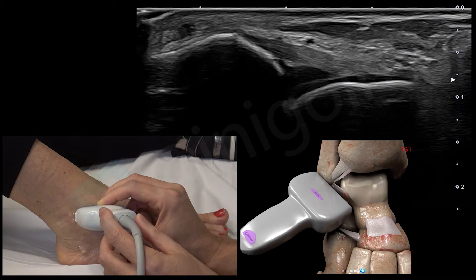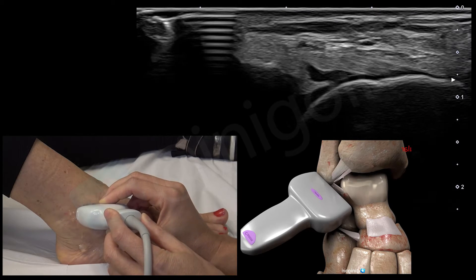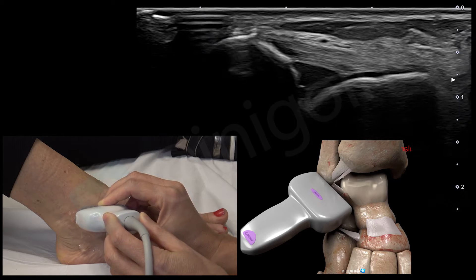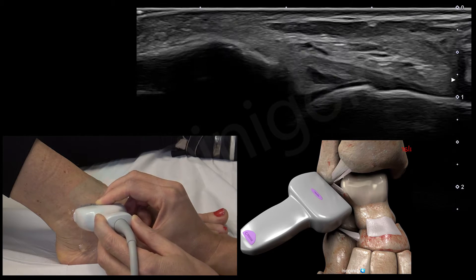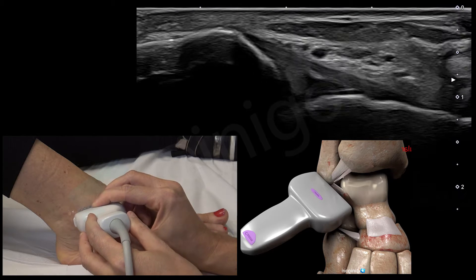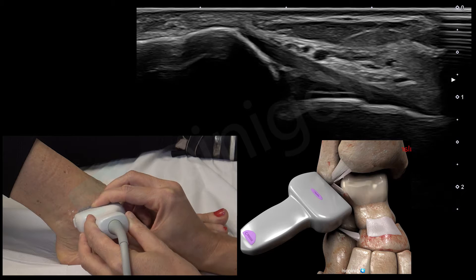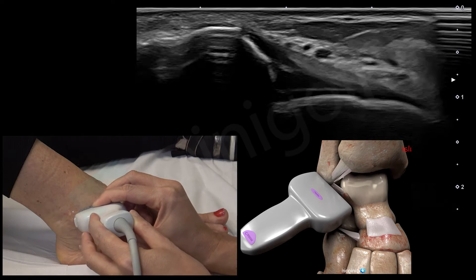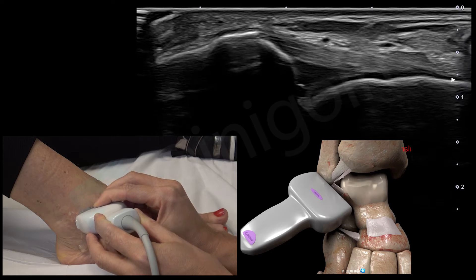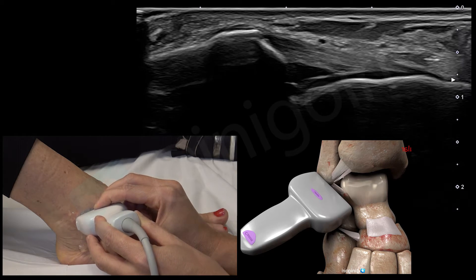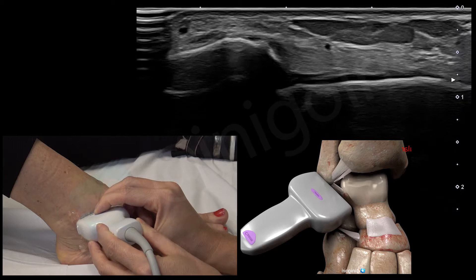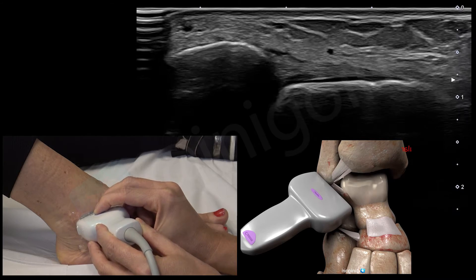Notice that if we push this side of the probe, we will reach a better image, because if we are pushing the rear of the probe we have anisotropy, and sometimes we can think that this is a mildly injured ligament — but this is not. This is a normal ligament. Always take into account that the orientation of the probe is very important to check this ligament. There are two fascicles: the superior one is this one, and as we go downwards we'll notice this small fascicle here, very subtle in this case, which is the inferior one, just at the tip of the fibula.